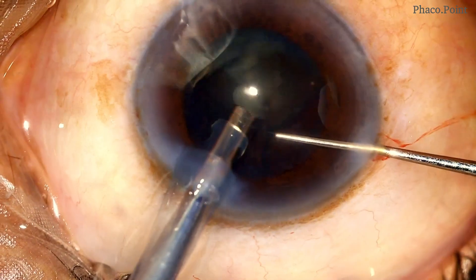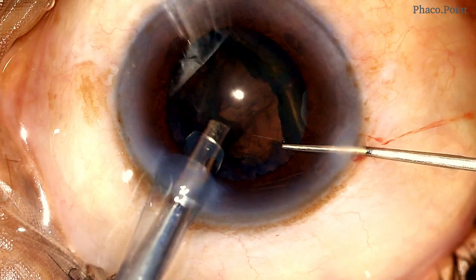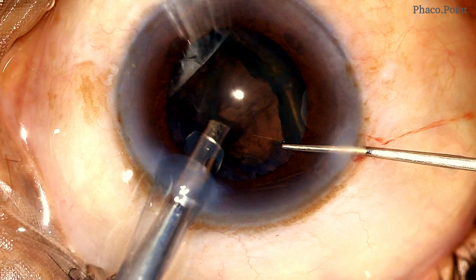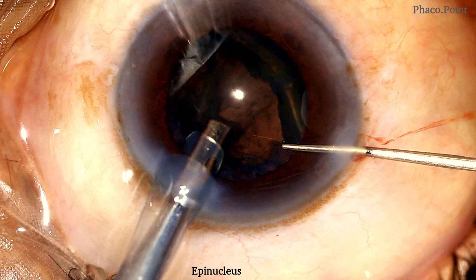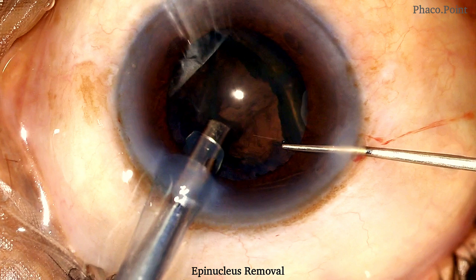This brings us to the end of nucleus management, at the end of which I proceed to remove the epinucleus in the epinucleus mode of phacoemulsification. Let's see what happens at the end of that.